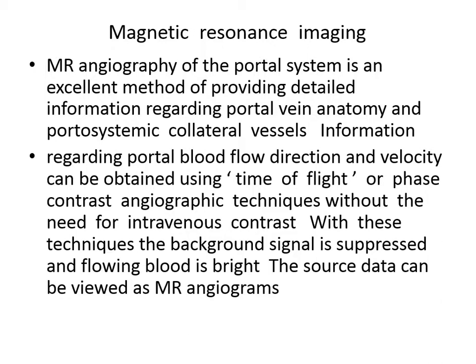Portal hypertension first shows decreased velocity, then reversal, with time. In mild it will be decreased. In moderate, a lower decrease. Then the severe portal hypertension will be the opposite direction, moderate to severe. The blood will go to the spleen instead of from the spleen. It goes back to the spleen instead of coming from it. Okay.